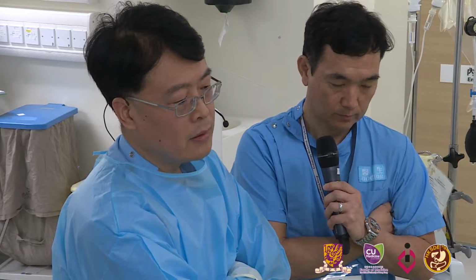I think we don't have the full thickness device at this moment, and I think this lesion is not feasible because the size is too big. But we may end up in a full thickness resection for that, from looking into the luminal appearance of that lesion.